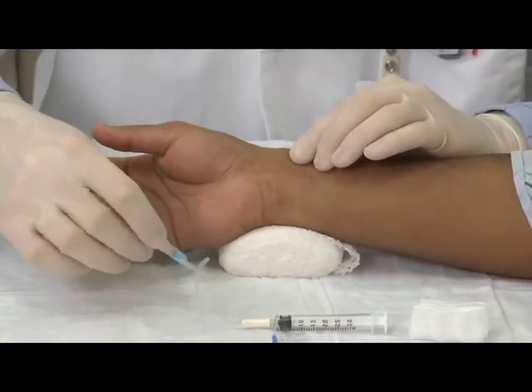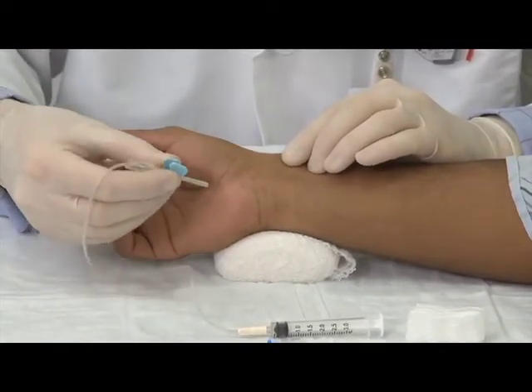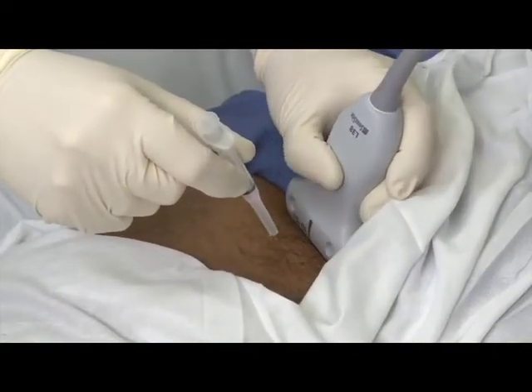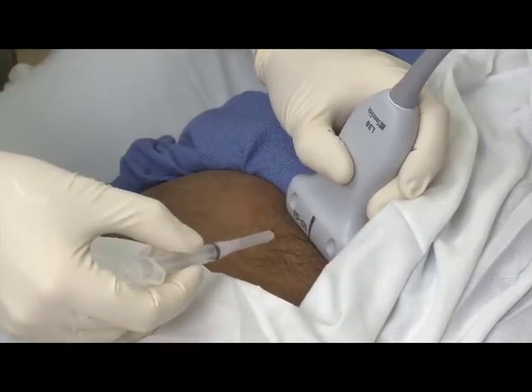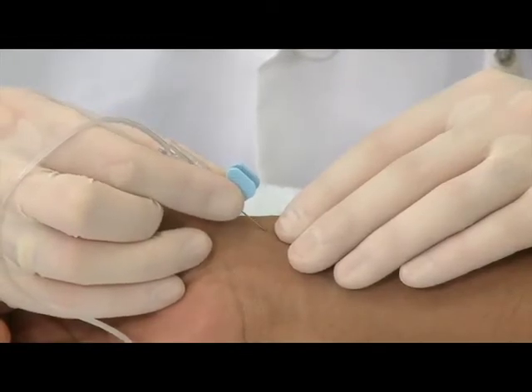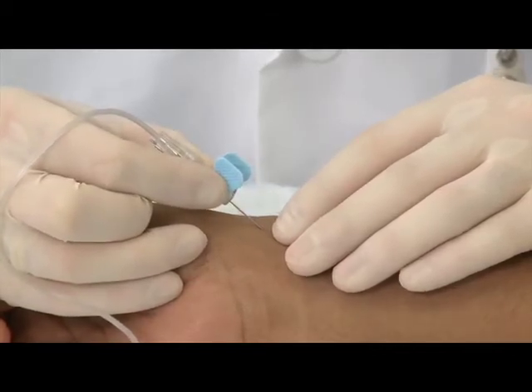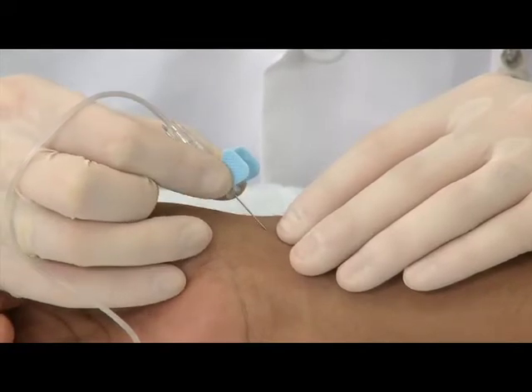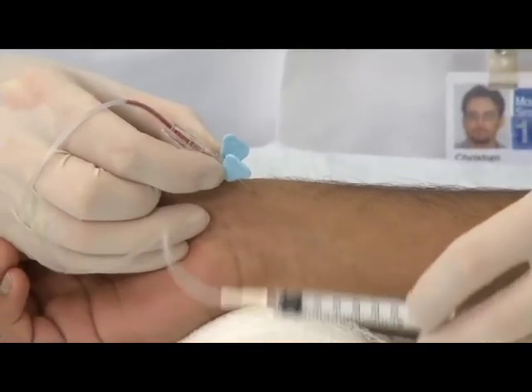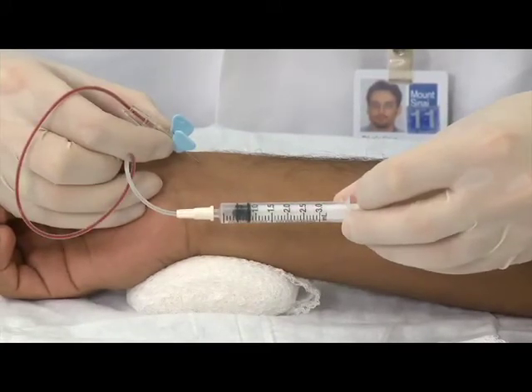While feeling the arterial pulse with the non-dominant hand, or observing the femoral artery non-compressible pulsations laterally to the compressible femoral vein, or the axillary artery pulsations in the axilla on ultrasound, advance the needle slowly with the dominant hand towards the projected or palpated pulse, or ultrasonographic projection of the artery, at a 45 to 60 degree angle. Observe spontaneous arterial pulsatile filling of the syringe or butterfly tubing. Adjust the needle position if needed.